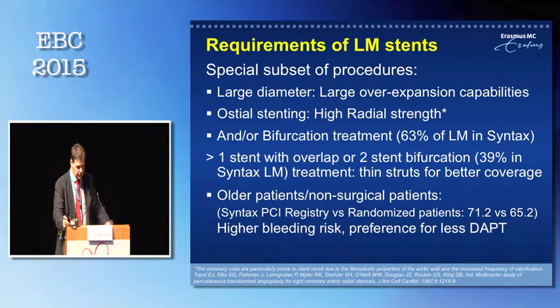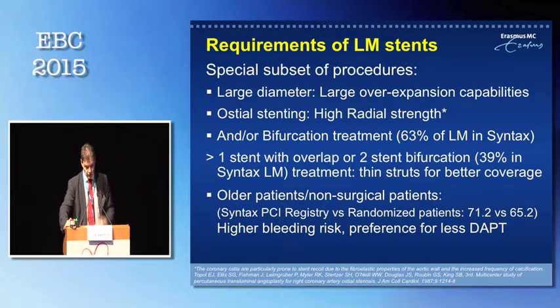And I think it is reasonable to think about thin struts, which have the fastest and best coverage in a rapid moment. This time to coverage is also important because in general our left main PCI patients are significantly older than surgical patients. If you compare the PCI registry in Syntax, that was 71 years old versus 65 years old in the randomized study group. And the higher bleeding risk is especially relevant for these elderly patients, and they prefer a shorter duration of DAPT.